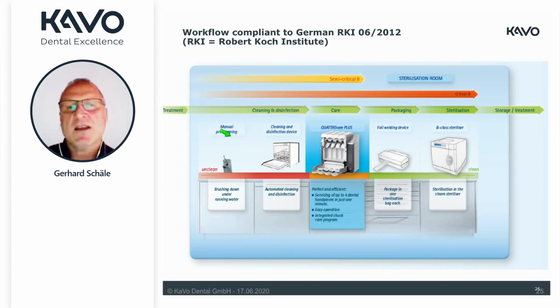because the automated system of the thermal disinfector will wash out all the oil. That means, if the instrument is leaving the thermal disinfector, the oiling is a must before you bring it to the client. And it's also always a must to spray, to oil it before you put it in the sterilizer. We want to make sure that clean oil, which is, by the way, fully sterilizable, will be placed into the instrument. Then it will go into the sterilizer.